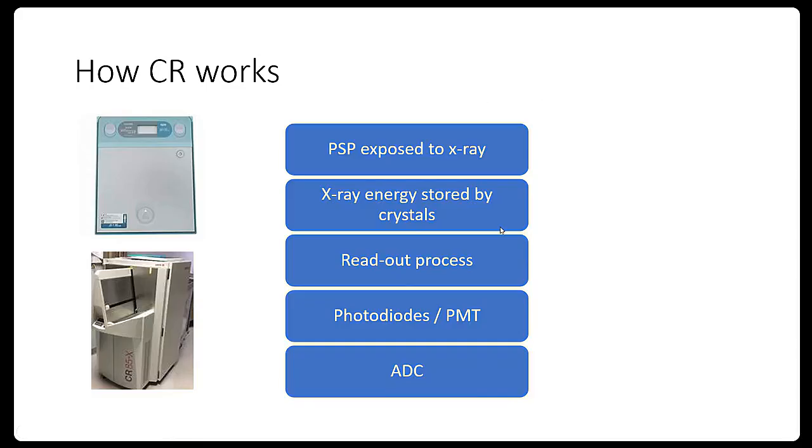We can use the same cassette for further studies. So how will we erase the image from this cassette?